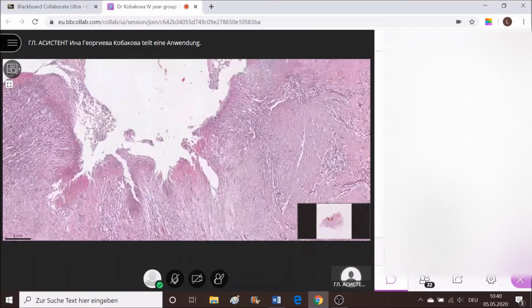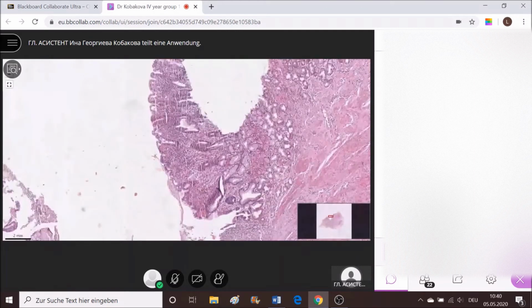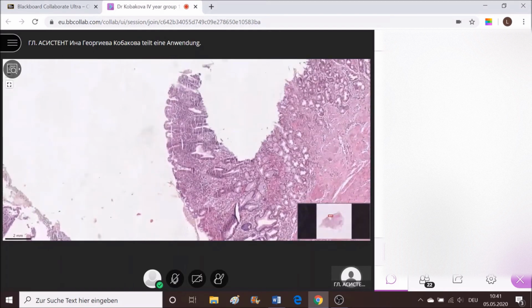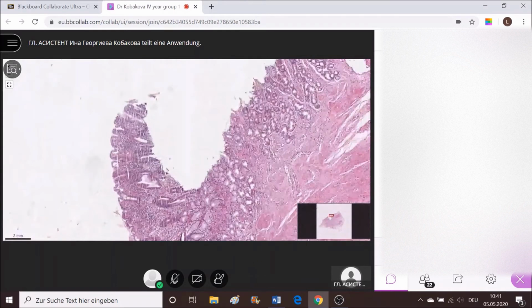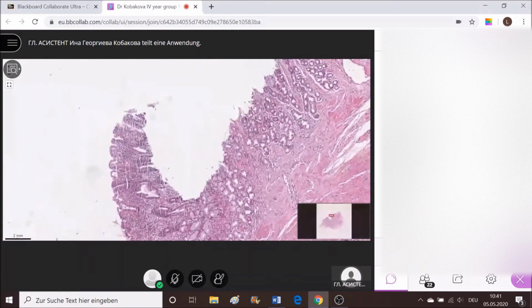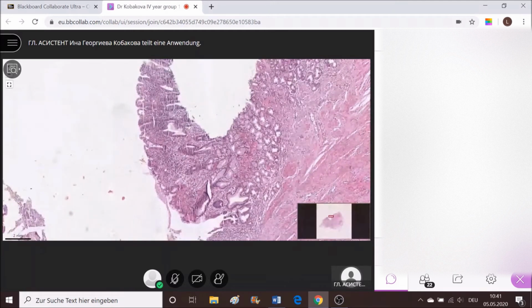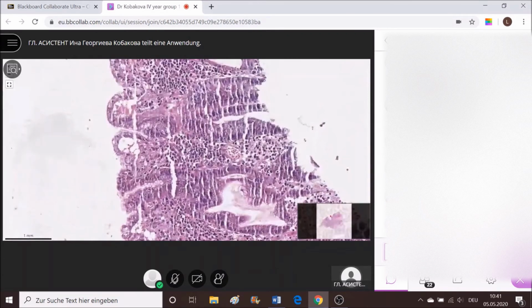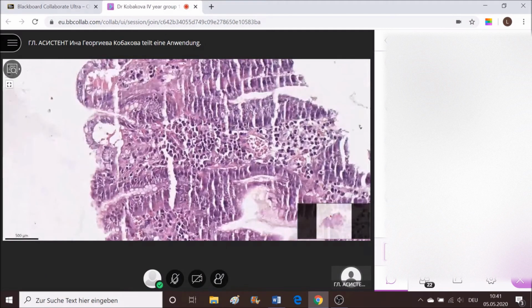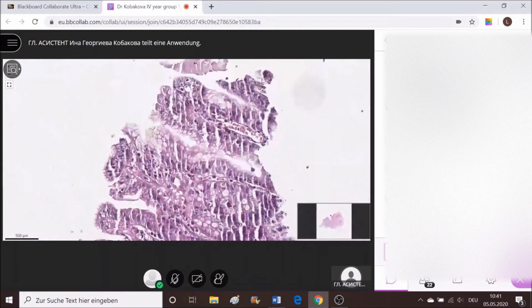Now let's speak about the margins of the stomach ulcer. What do we expect to see here? This is the stomach mucosal layer. These are remnants of the glands in the chorion, made of chief and parietal cells. And here we have some inflammatory infiltrate, which is demarcated, especially in the submucosal layer, made of many lymphocytes combined together. Some hyperemia, some artificial hemorrhages here. We mark these as circulatory changes.